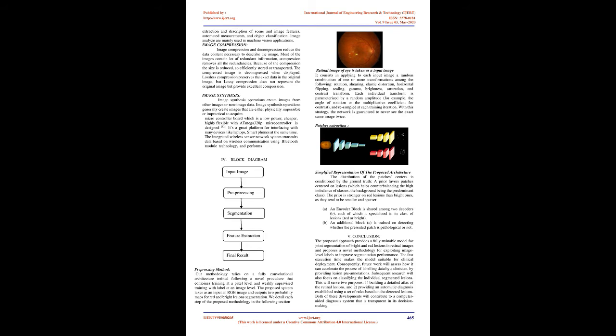The knowledge about a problem domain is incorporated into the knowledge base. The knowledge base guides the operation of each processing module and also controls the interaction between the modules. Not all modules need be necessarily present for a specific function. The composition of the image processing system depends on its application. The frame rate of the image processor is normally around 25 frames per second.